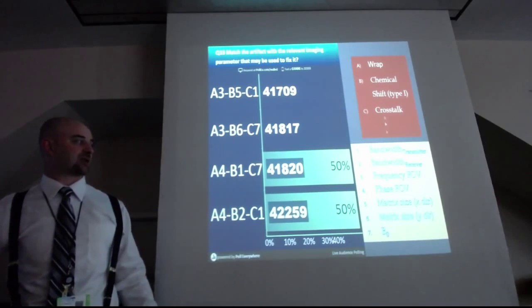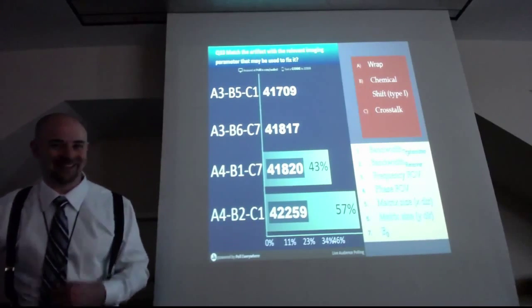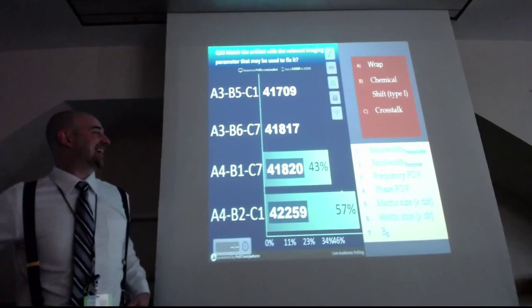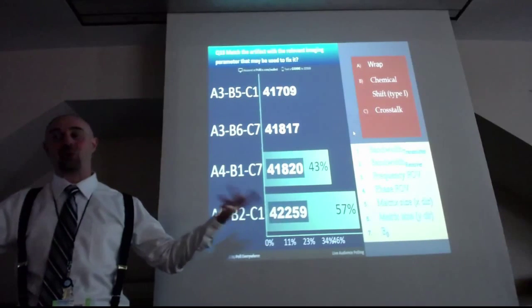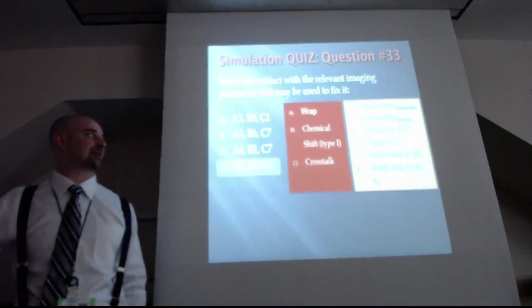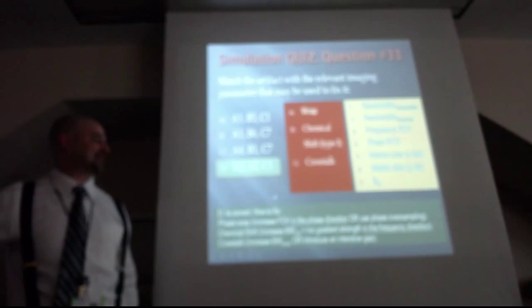And then crosstalk artifact, well, that's in the slice direction, so that's the transmitter. Good job. If you increase the transmitter bandwidth, you'll have more frequencies included, a better shaped sinc pulse for your RF pulse, and thus a better slice-like profile, and less crosstalk artifact. Okay, good.